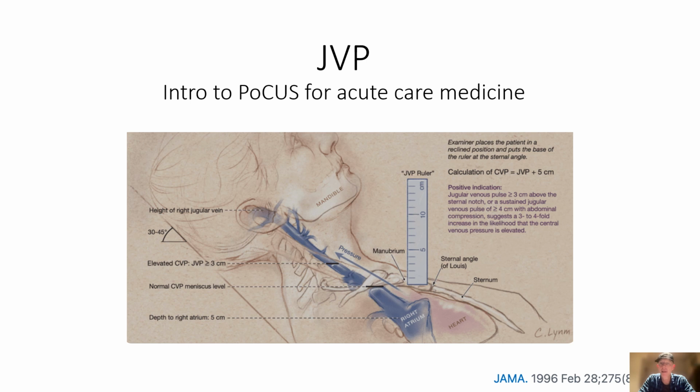I'll also spend time reviewing the anatomy and nuances of the appearance of the IJ using ultrasound. I have found that, as with most ultrasound applications, there is an obligation to provide the necessary background in order to help the learner avoid misinterpretation and clinical errors.